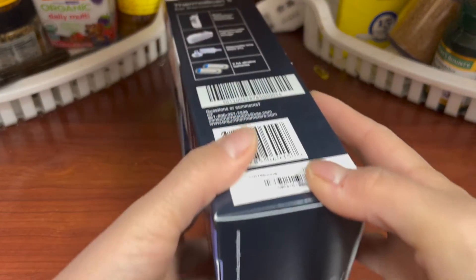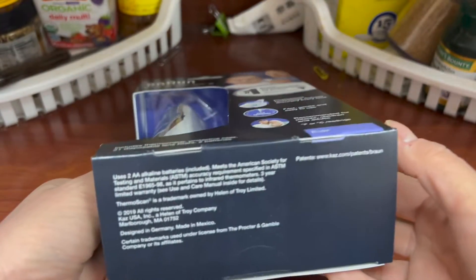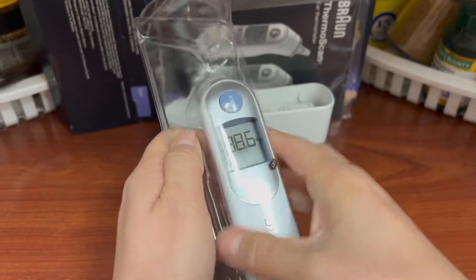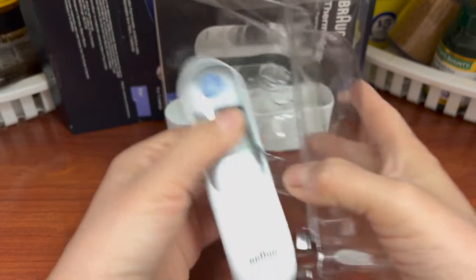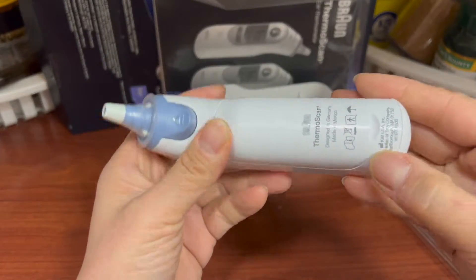Hi, today I would like to show you this ear thermometer from the Braun brand, the ThermalScan 5. This is the package. It comes in a holder and also a box of ear probes.